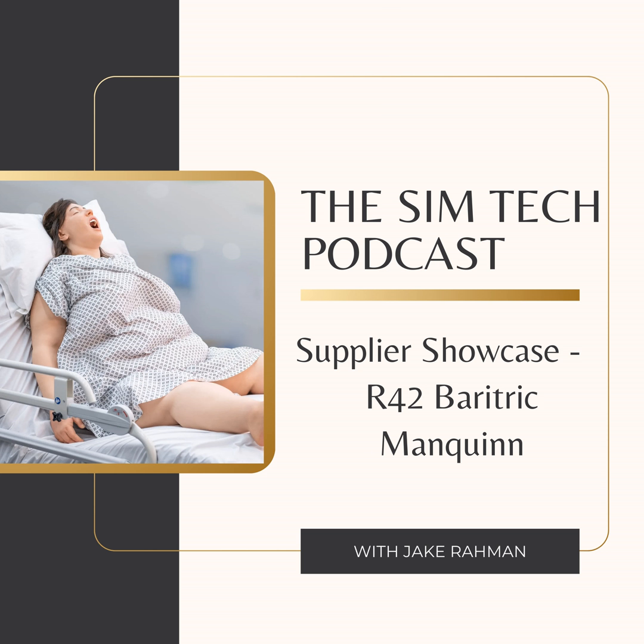What did you do for your eyes? Is it eyes open or eyes closed? You've got a choice of eyes open or eyes closed. That's good, because it's one of the things I've always kind of hated about live cast. I know there's a few techs out there that are brave enough to chop the eyelids off and retrofit them onto their mannequins, which blows me away, I'm not that brave. But yeah, it always feels weird when maybe you want them to talk and they've got their eyes closed. We're not talking about Simtex chopping off their own eyelids, are we? Because that wouldn't be right. No, we use someone else's, obviously.